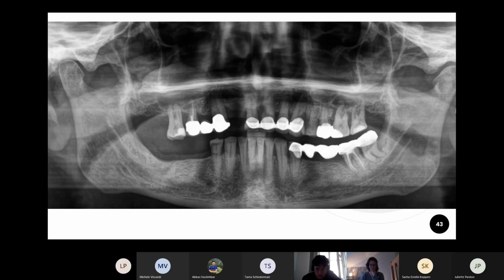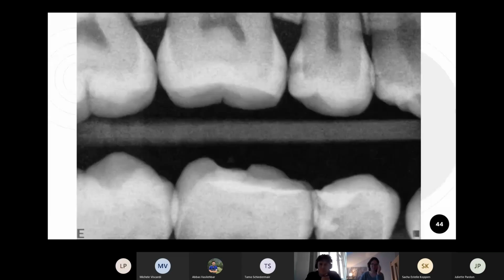And in number 4, in the 4th quadrant, it's hard to say if it's caries or not, because the line of the gingiva you can see next to it also goes in this area. So it might again just be that the overlapping tissue creates a brighter contrast in comparison to the rest of the tooth. So you would maybe have to do a bite wing there or a clinical examination. Okay, so let's go to the next X-ray if no one has anything I missed.